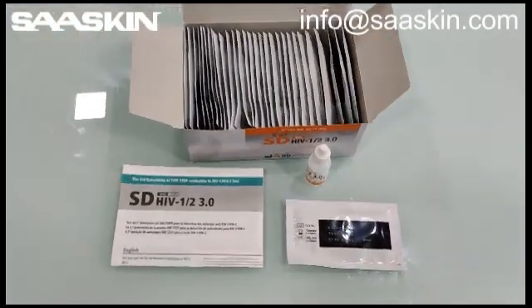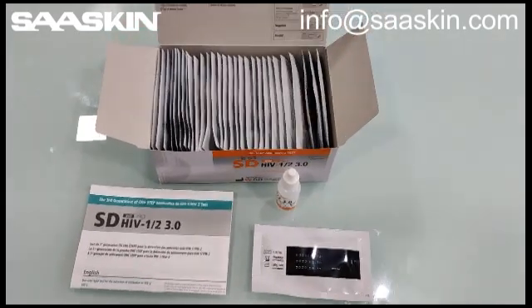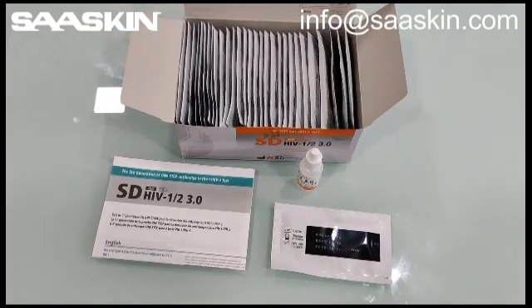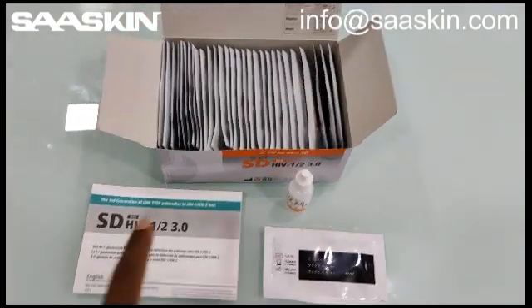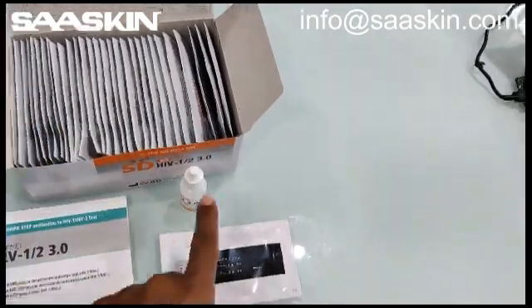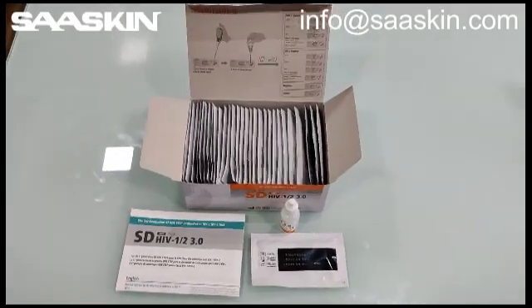Just quickly to recap the whole box: the 30 test cassette pack of SD HIV 1/2 test kit contains one instruction manual, 30 test cassettes duly packed, and one buffer solution bottle. This is the complete pack. Thank you.